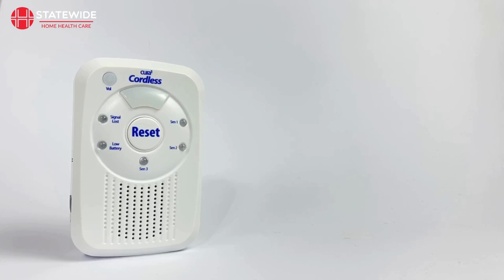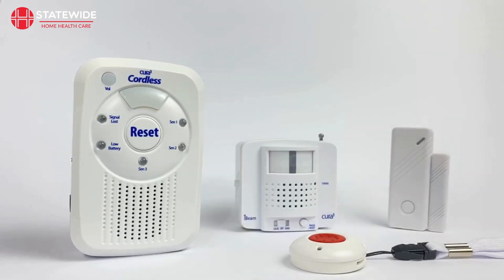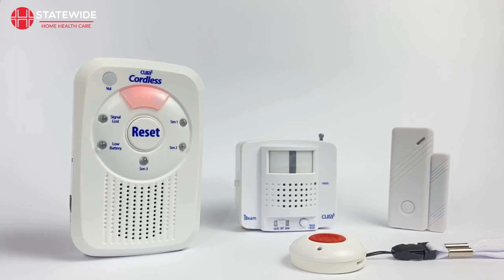We will start by explaining how to connect call buttons, switches and sensors. This will cover most of the Cura-1 devices that don't include a transmitter for a pad or a mat. With your monitor in programming mode, trigger the call button or activate your switch or sensor to pair that device to your monitor. The first available sensor slot will be filled and the sensor number that it is associated with will illuminate and beep briefly to indicate successful pairing. Doing this will cause your monitor to automatically exit programming mode.